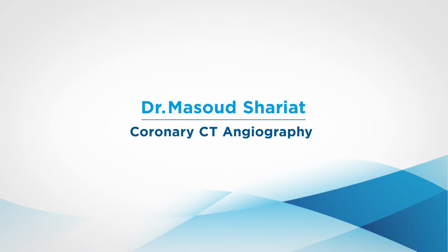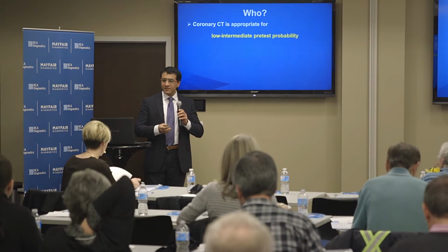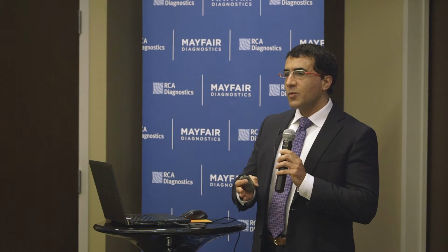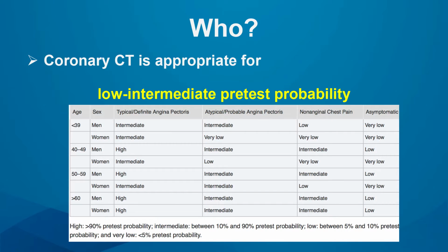All right, so I'm going to talk about coronary CT in the outpatient population. The first common questions: who should get it, why we do it, and how it benefits the patients. So we have the appropriate criteria for coronary CT.